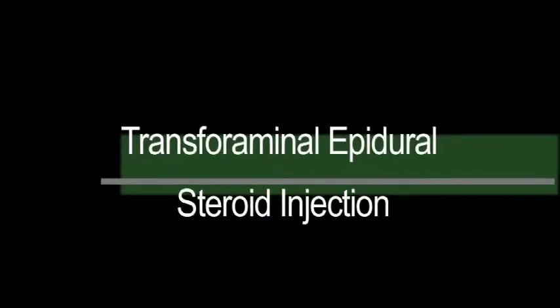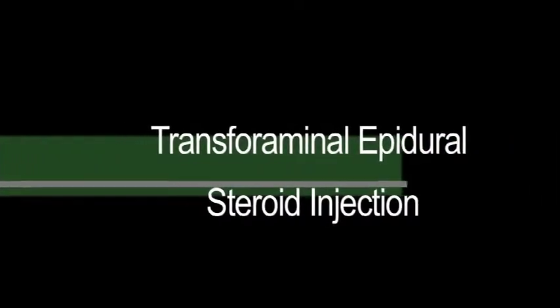I wanted to briefly take a few moments to explain the basics of the procedure that we're doing and why. First procedure that we do is called a transforaminal epidural steroid injection. That is typically done for patients who have a quote-unquote pinched nerve. When we look at the spinal model, this would be a lumbar spine. If it were in me, it'd sit just about exactly like this.